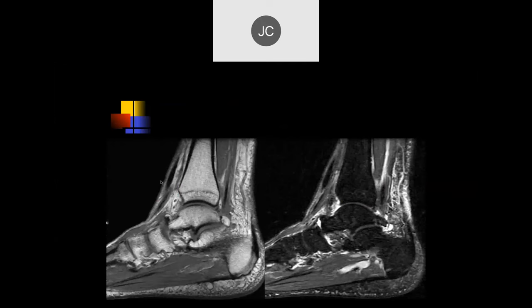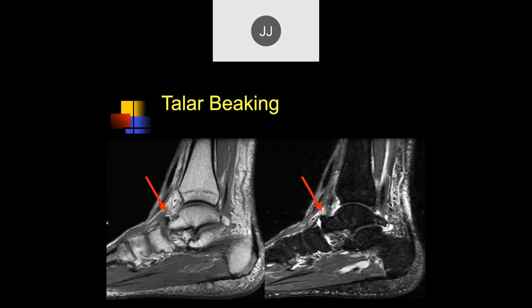There's some incongruity of the dorsal talonavicular joint and a spur there. This is called talar beaking. If you see it in a young person, you need to look for congenital fibrous or bony fusions — that's the classic cause of talar beak. Repetitive trauma, such as seen with ballerinas, can also produce this condition.